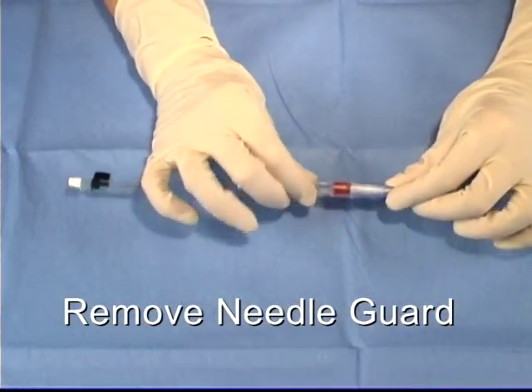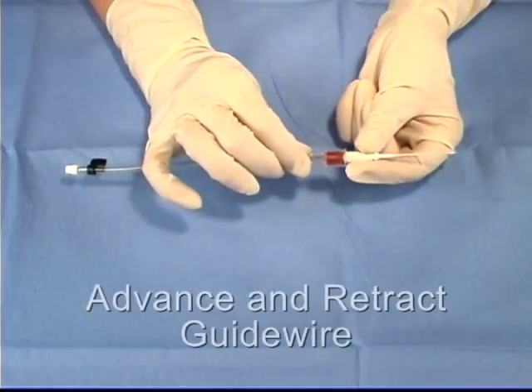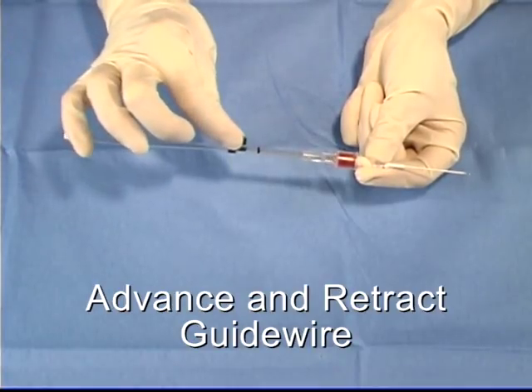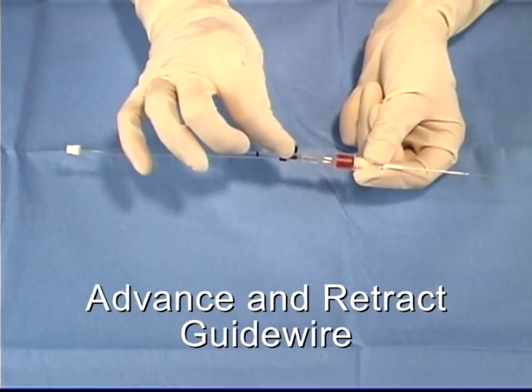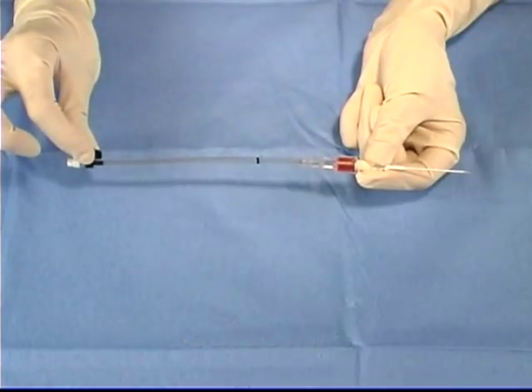Remove the protective guard. Advance and retract the spring wire guide to ensure proper function. Remember to begin the insertion with the wire fully retracted. If the wire is not fully retracted, it will act as an obturator in the needle and blood return will be hindered.